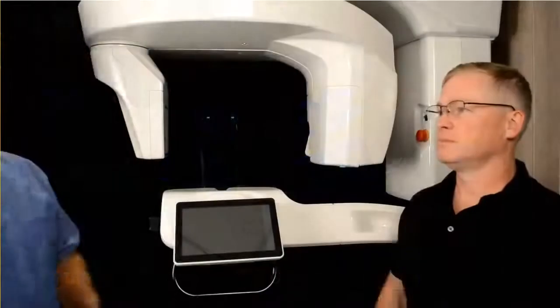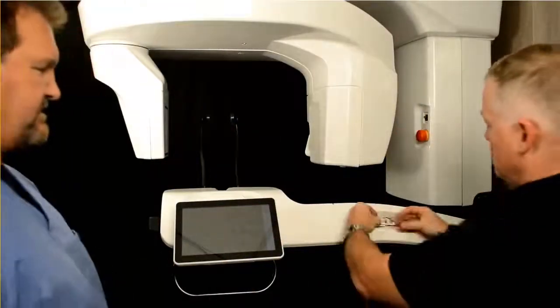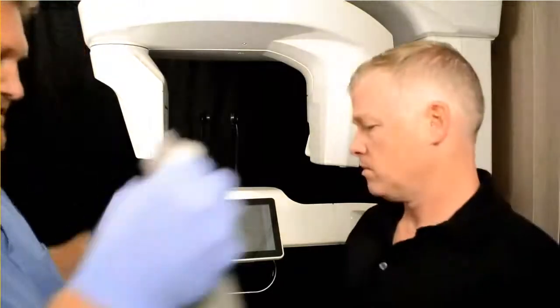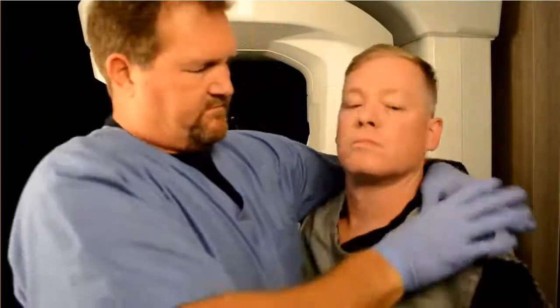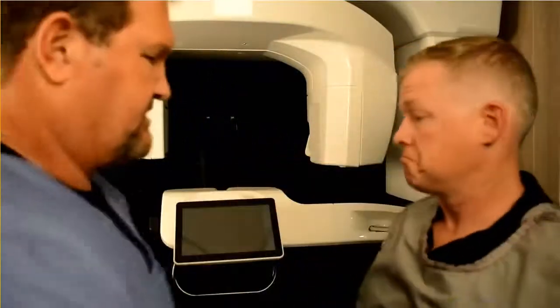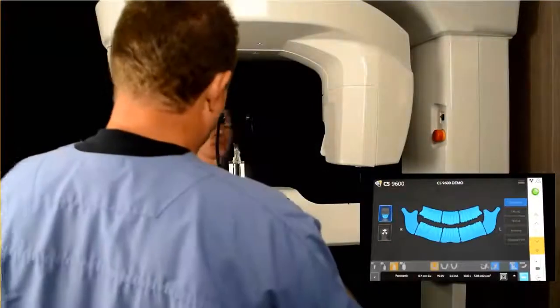Ask the patient to remove and place all metal objects in the jewelry tray. Ask the patient to wear a lead apron. Ensure that the apron lays flat across the patient's shoulders. Ask the patient to enter the unit.